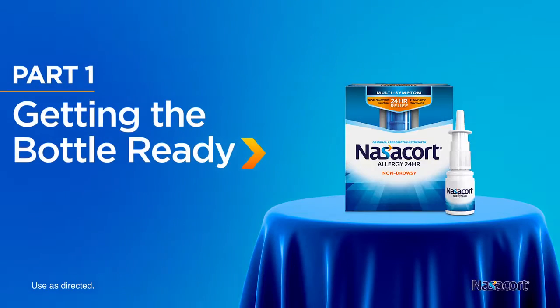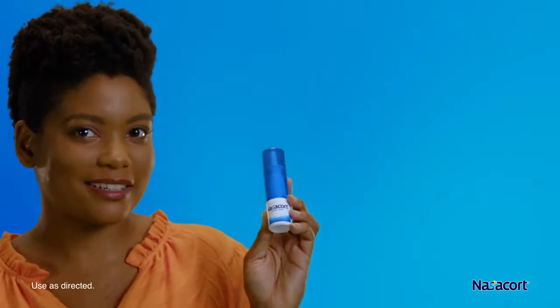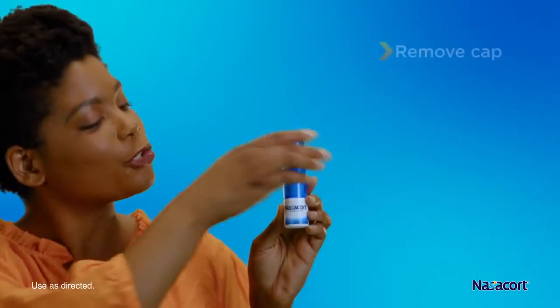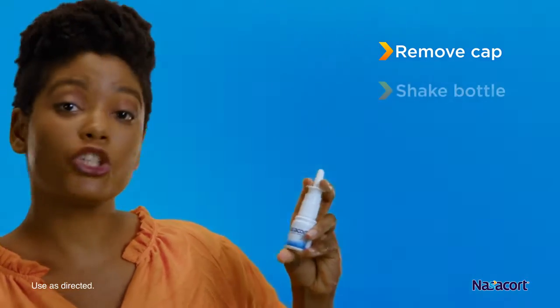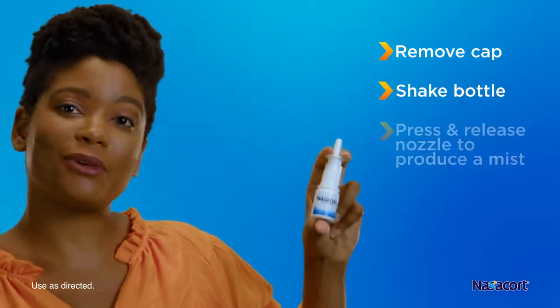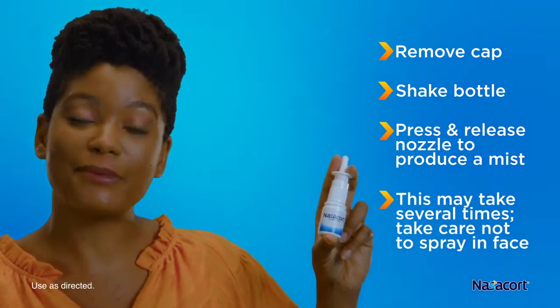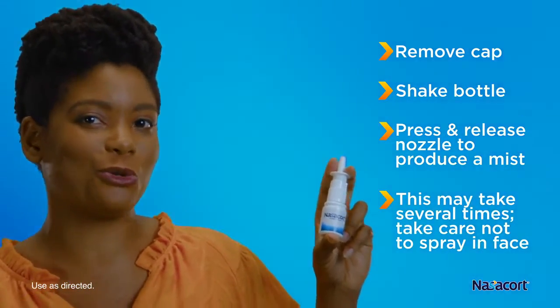Here's how to use Nasacort. Before using your new bottle of Nasacort, you have to prime it. Just remove the cap, shake the bottle, tilt it away from your face, and press and release the spray nozzle until you see a fine mist in the air. Repeat these steps if you haven't used your bottle for more than two weeks.